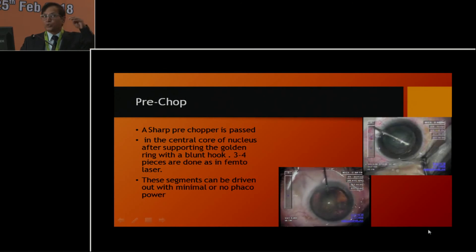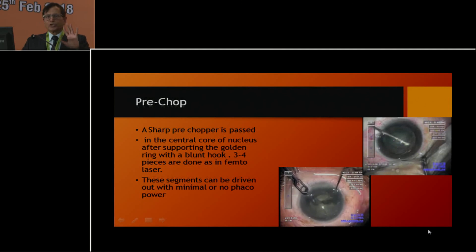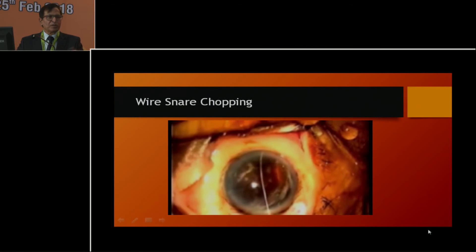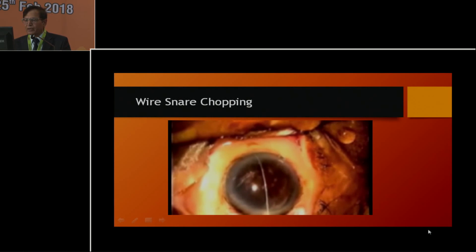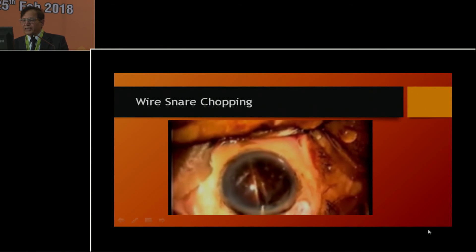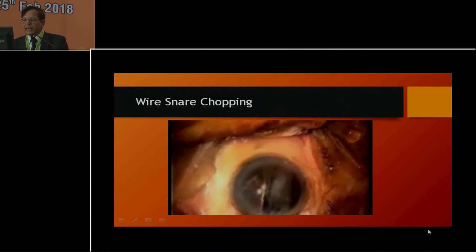In pre-chop, you support at the periphery and split the nuclei. The main objective is to reduce the phaco power. The wire snare can split the nucleus into many pieces which you then take out. Here you don't require much phaco energy — almost zero power phaco. You can bisect into two pieces and take them out one by one with a tooth forcep.